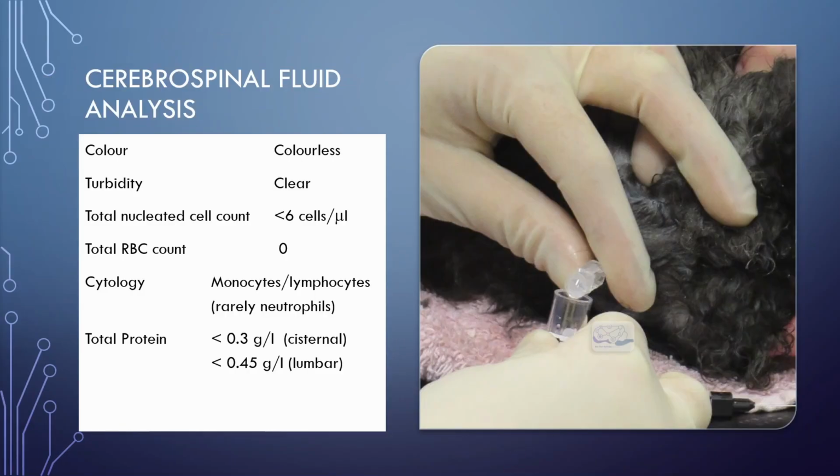For the cerebrospinal fluid, the routine analysis is that you should check its colour, and it should be colourless and clear. It's analysed for its total nucleated cell count. We look for the normal cells in the CSF, the monocytes and lymphocytes. Very rarely will you get neutrophils, and in most instances we consider the presence of neutrophils and eosinophils as abnormal. We shouldn't have red blood cells, but it is common to get a few because of iatrogenic contamination. And the total protein is these figures here that you can see. It's slightly lower in the cisternal site.